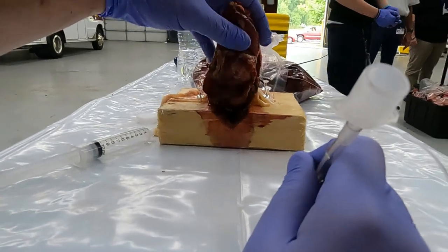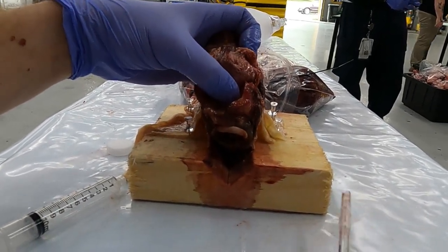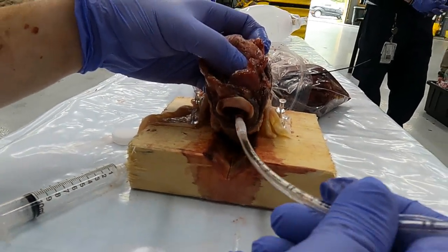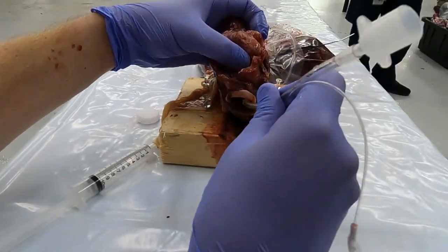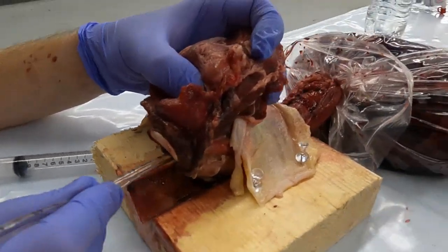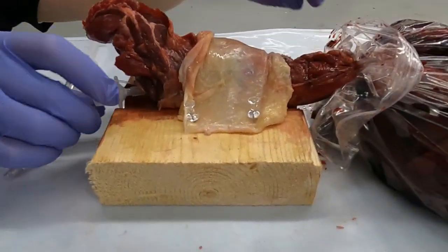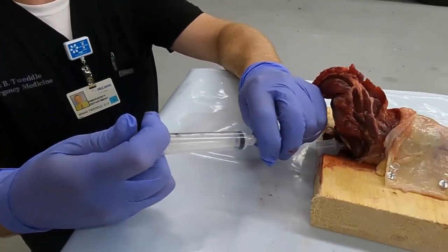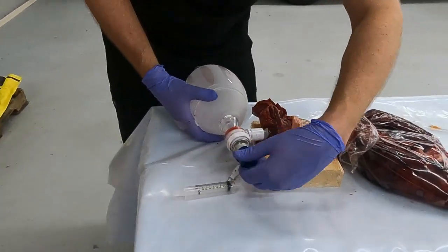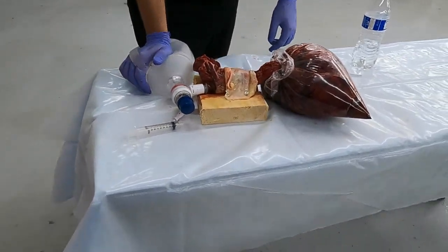We're going to use our hand to get our view. When we lift up we should be able to see our airway right here — this is the base of the tongue where my thumb is, and here's our airway with the vocal cords noted just below. We're going to advance our tube just like we normally would — no stylet today as a cost-saving measure. Normally you advance until your balloon just disappears, but for demonstration purposes we're going to bury it deep because of the hole in the trachea, over-inflate the cuff to try to get a seal, and add a lot of PEEP to inflate these lungs.